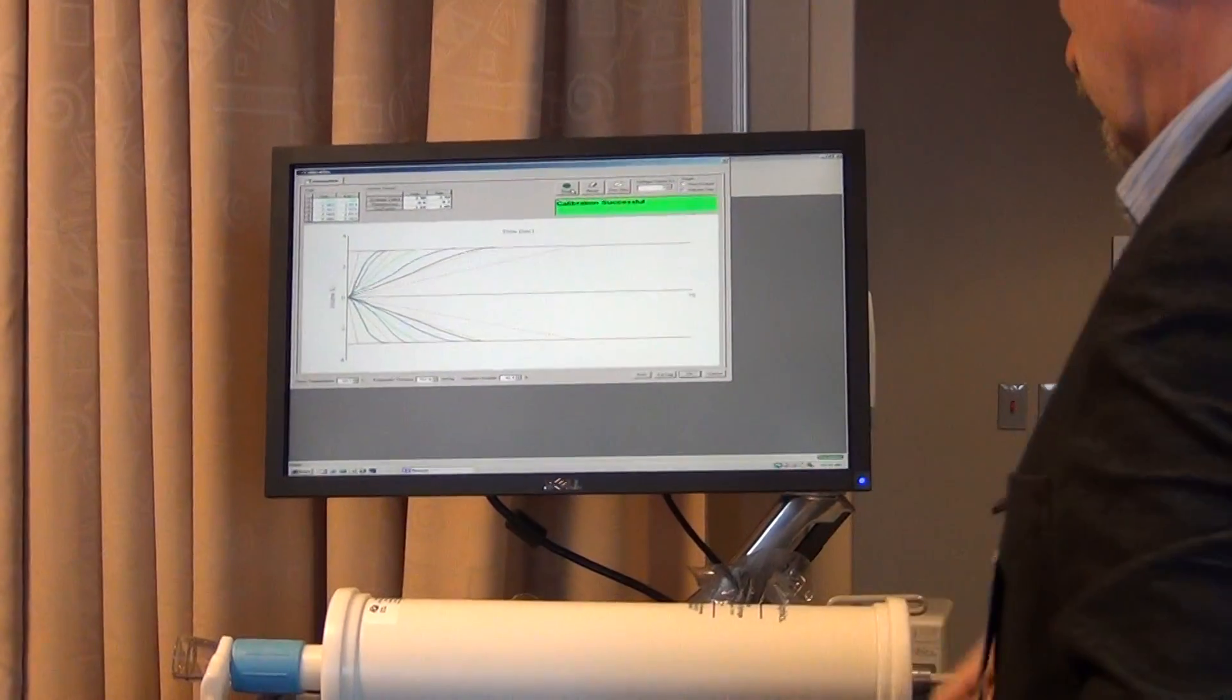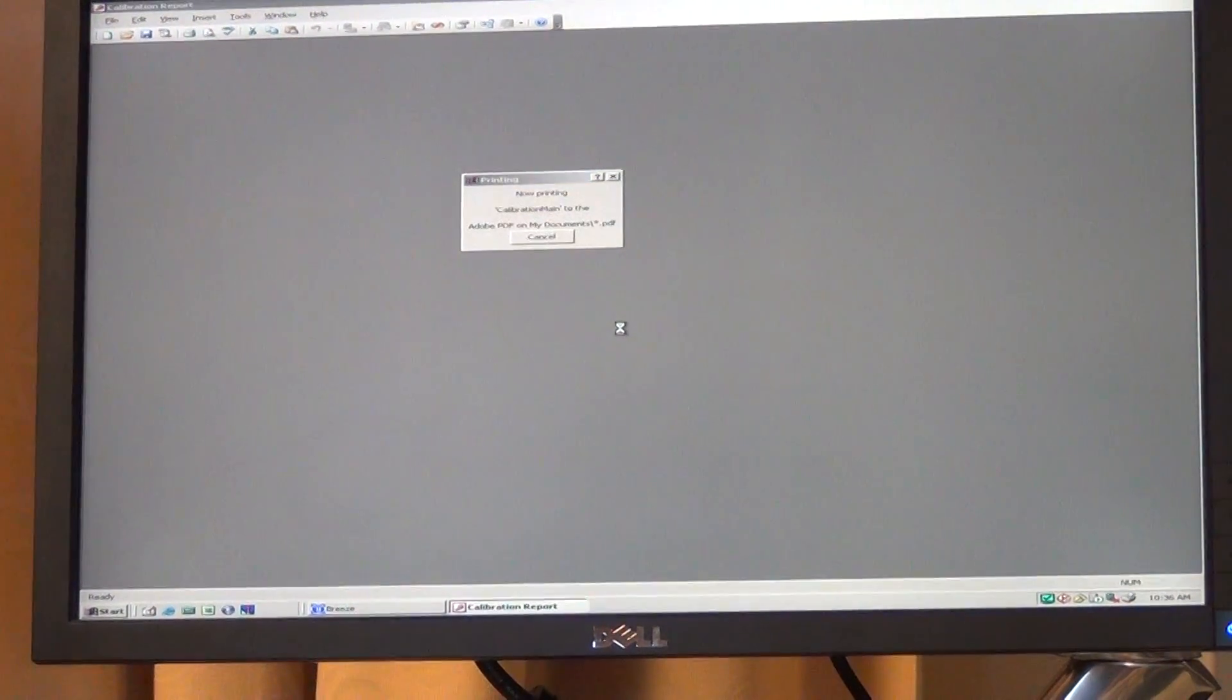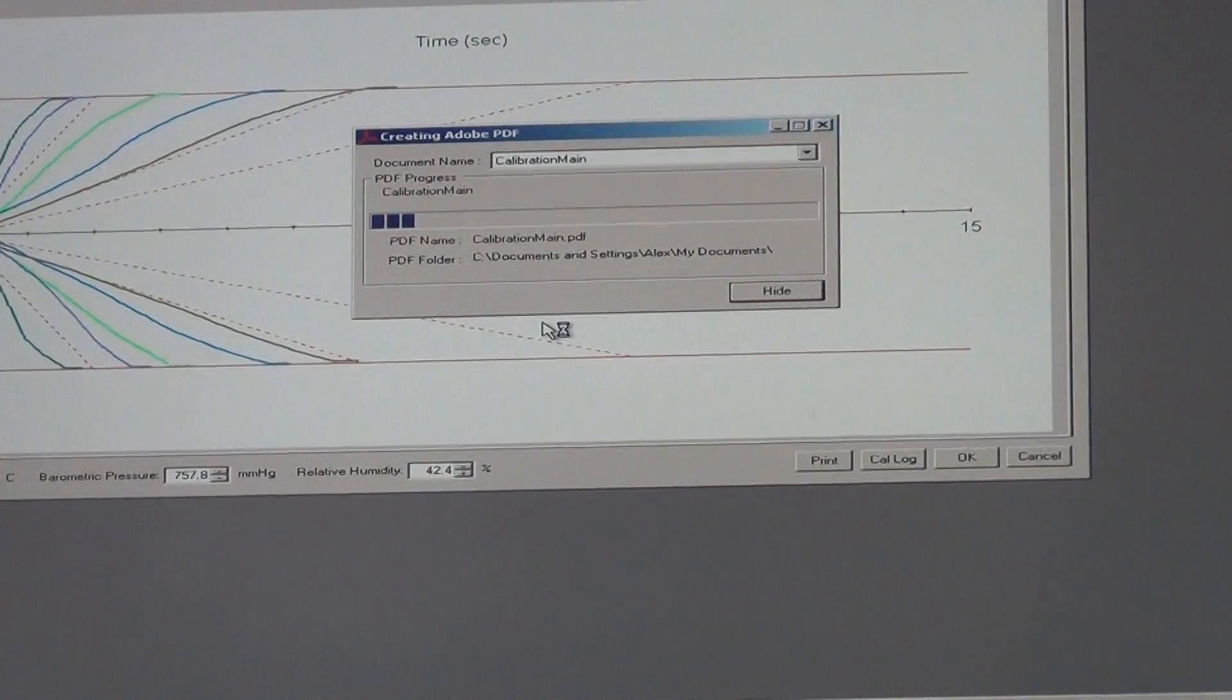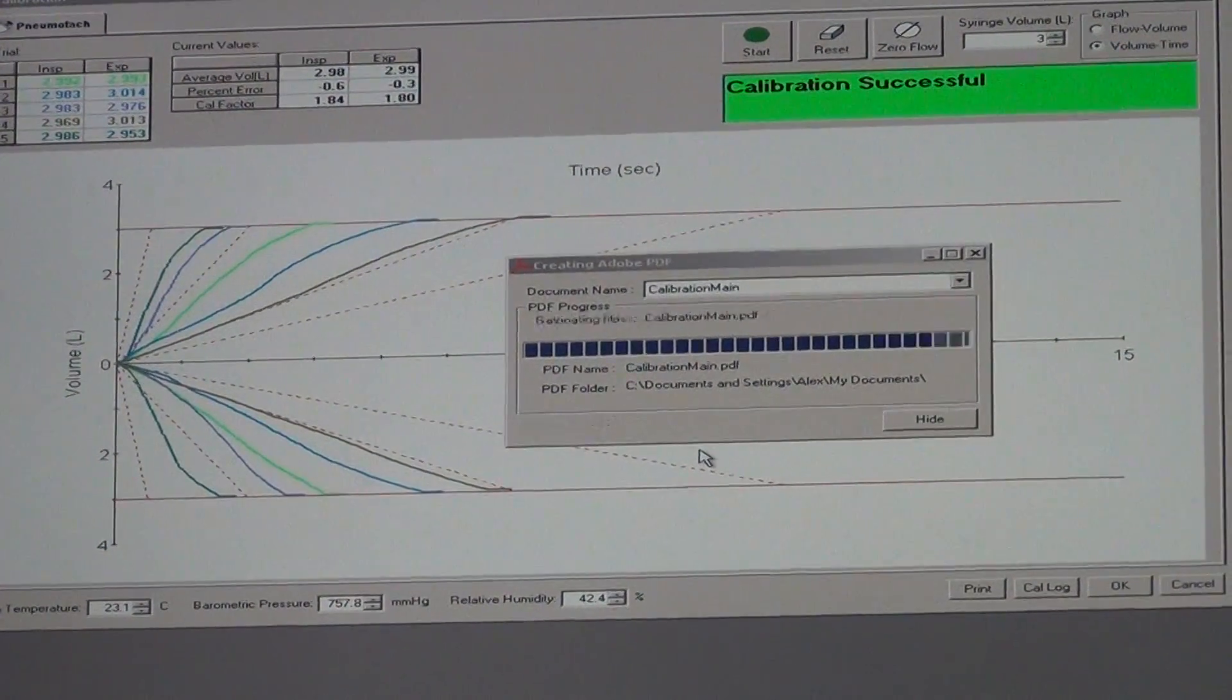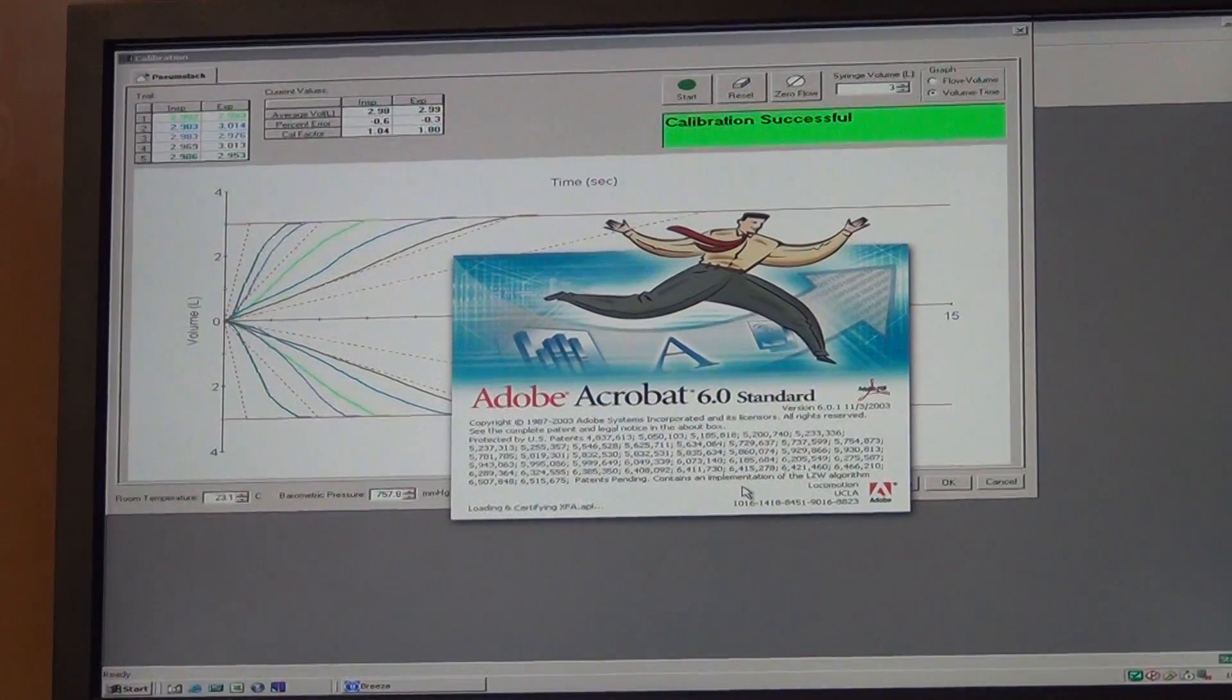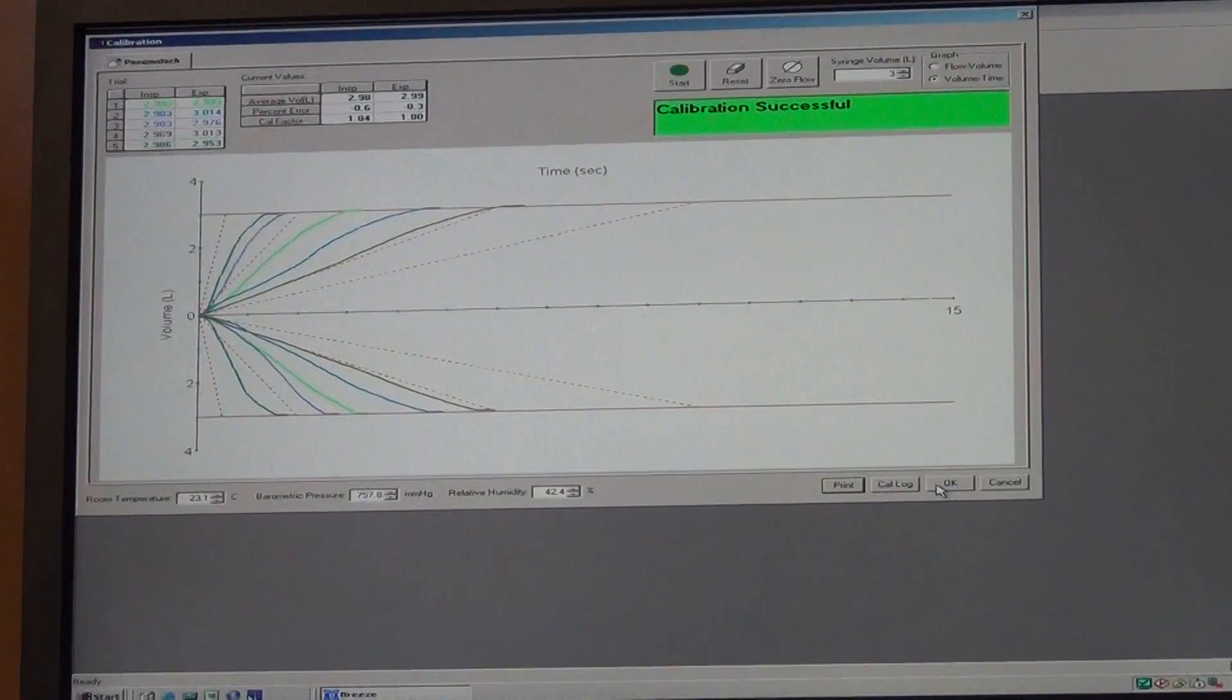And the calibration was successful. So now we save the file. You press the print button, press open, and save the calibration file as a PDF. We title the file calibration with the date of the calibration, so you can put that in whatever folder you need to on the desktop and save the file. As the PDF of the calibration file is loading, you press OK.